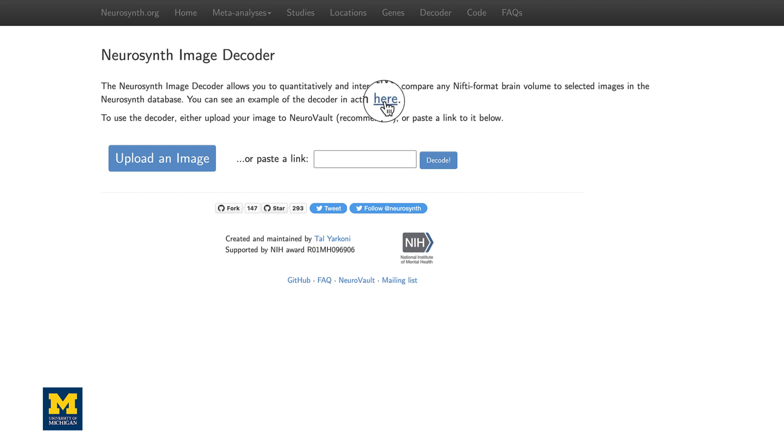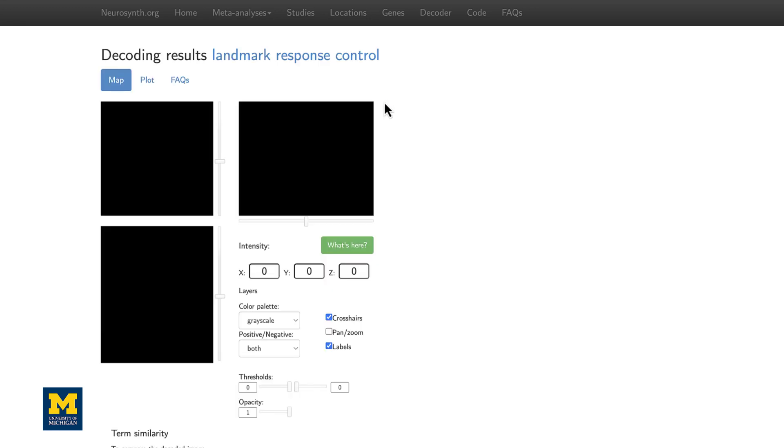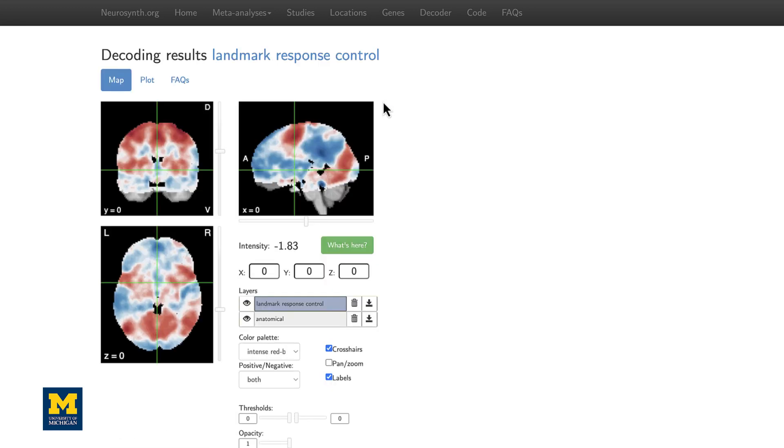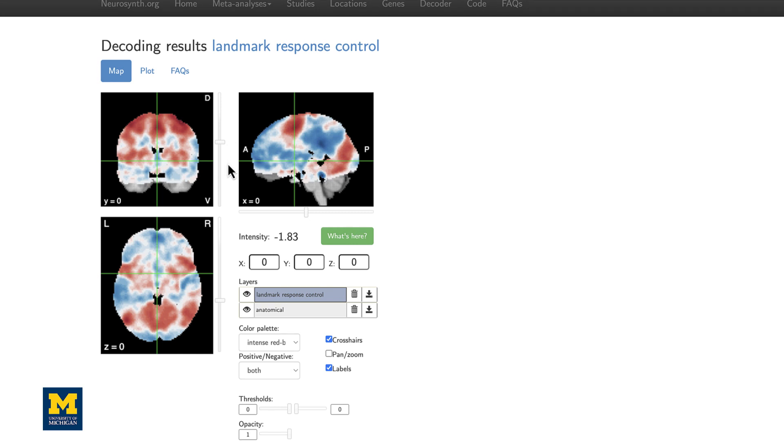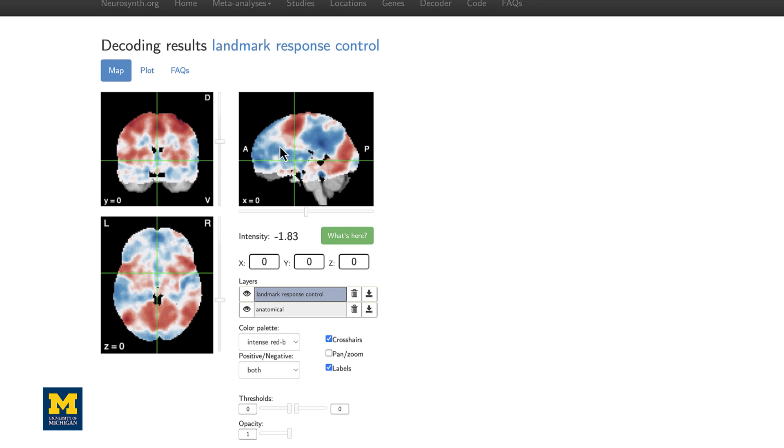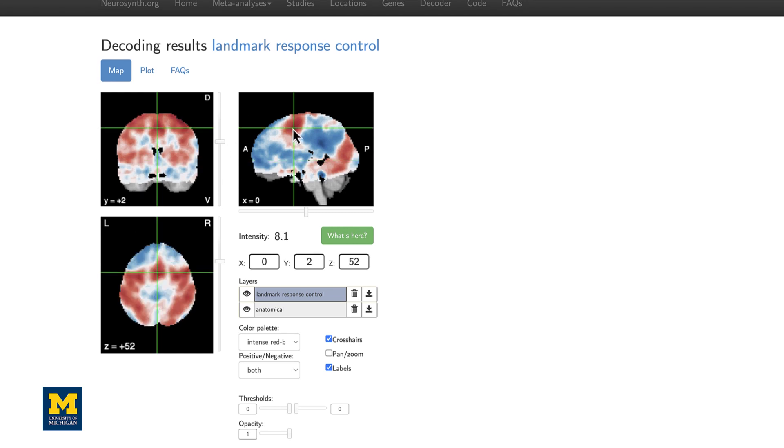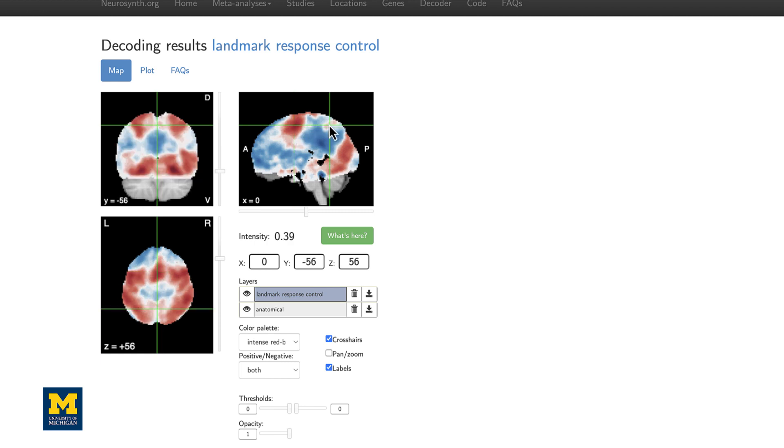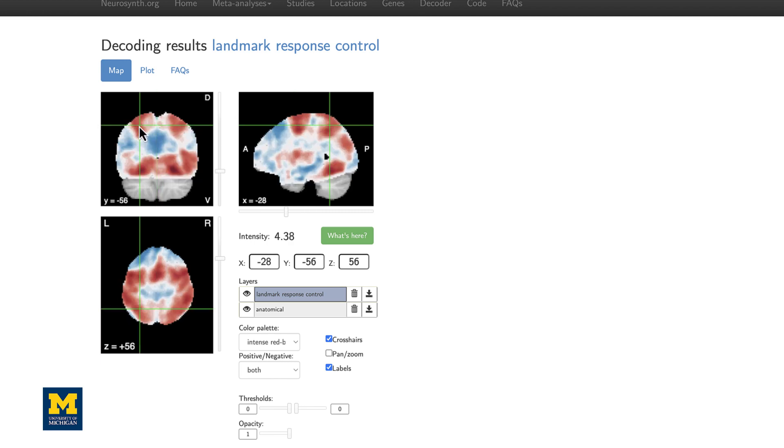For an example, let's click on the 'here' button and see an example map generated by Neurosynth. You can see in this image there's a high degree of activity in, let's say, the premotor or supplementary premotor areas, along with parts of the intraparietal sulcus.